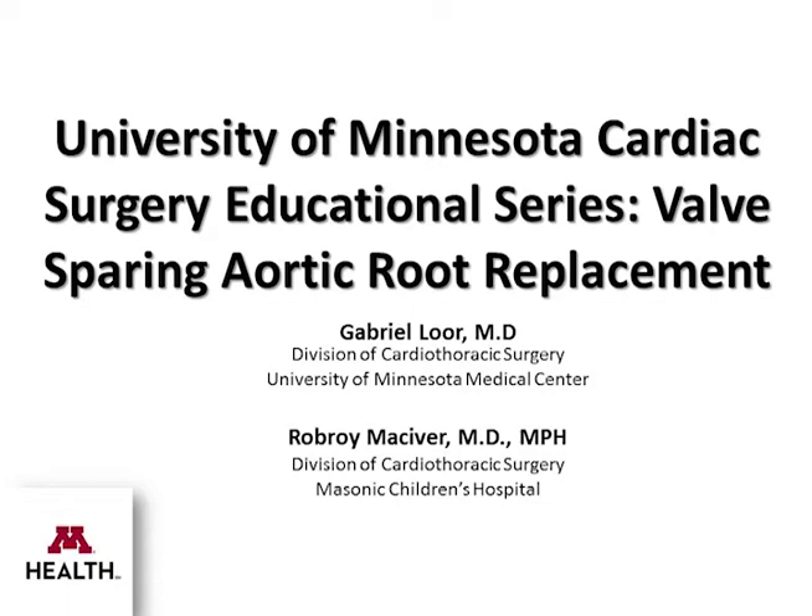Welcome to this University of Minnesota Cardiac Surgery Educational Series. This video describes the valve-sparing aortic root replacement. I'm Gabriel Loor, Division of Cardiothoracic Surgery.